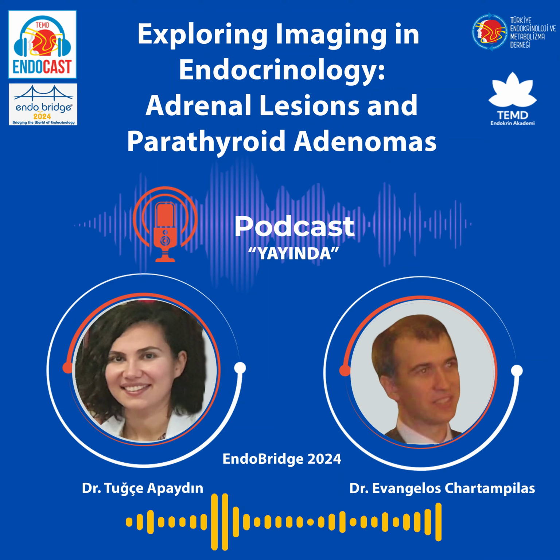And also, there are always traps, pitfalls, even with adenoma imaging or pheochromocytoma; there are always atypical cases. If you see something that is very brightly enhancing, even if it washes out, because the washout technique is a very sensitive one for detection of adenoma. But again, if it is, let's say, 140 post-contrast, and then it washes out and becomes 30, this 140 is not consistent with an adenoma. And sometimes up to 30% of pheochromocytomas may also show washout. So it all depends, and you should discuss the case with the radiologist for the next step, if any.